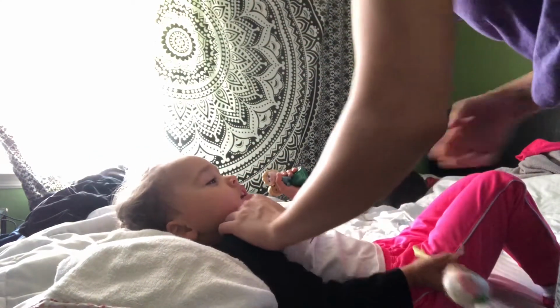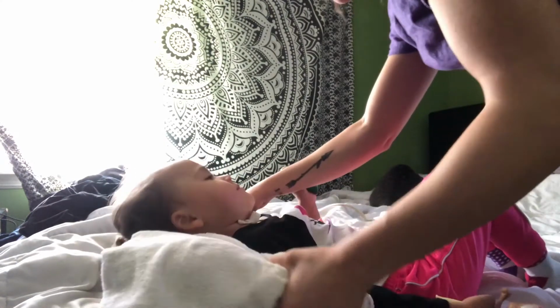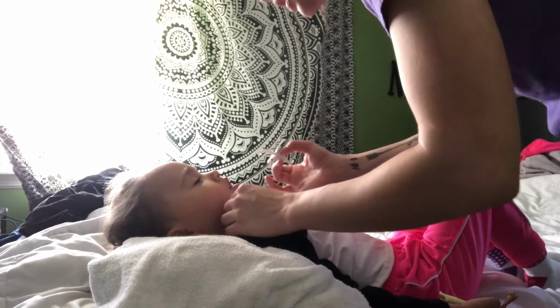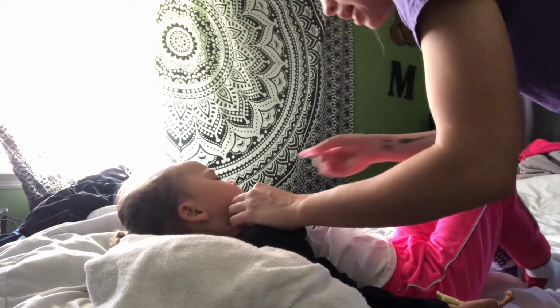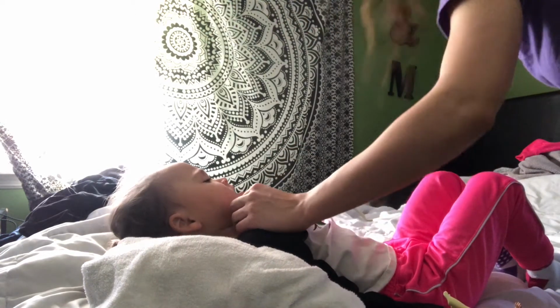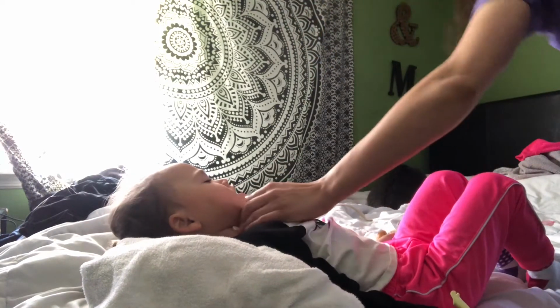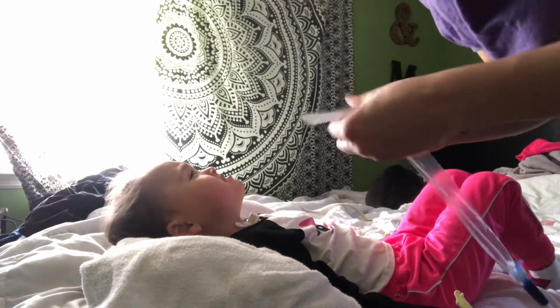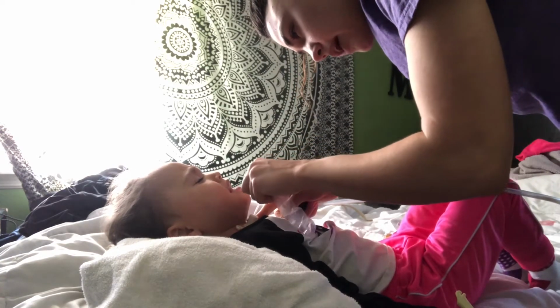Okay, lay back. Put your legs down. It's okay, they're just gonna watch. Look up to the sky. Oh, you know what? I completely skipped this step. I usually use a little bit of saline. You're okay. That one's empty. Before I change it, I suction out any secretions that are in there, because you never want to change a trach with secretions stuck in the old one. So you want to clear her out.